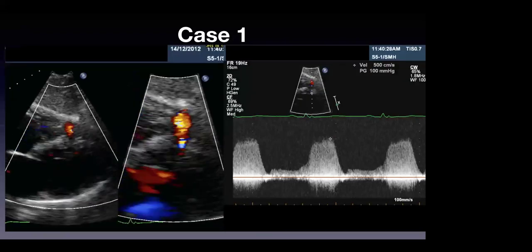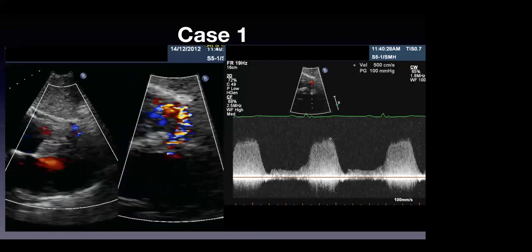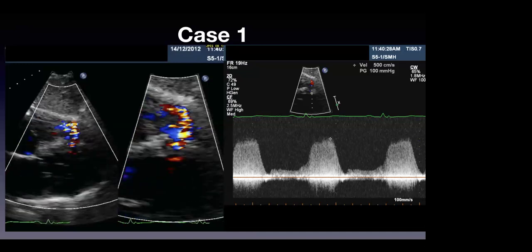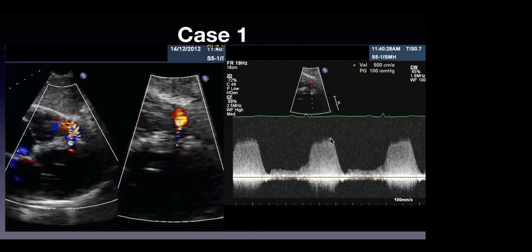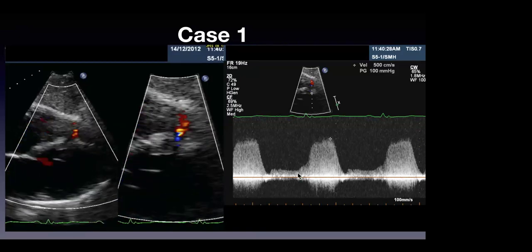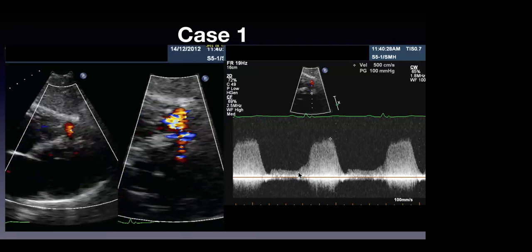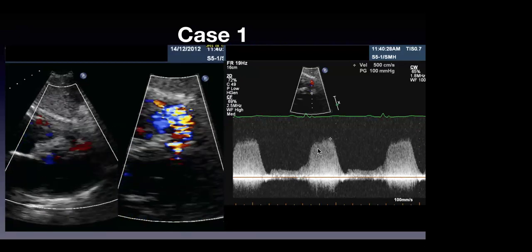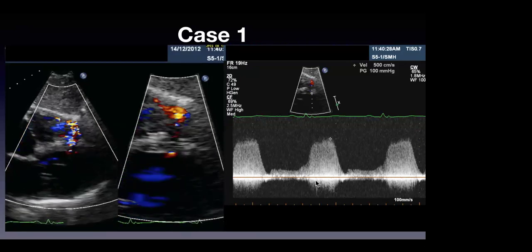And here's a subcostal view, really nice images, right? You can see we've interrogated in multiple views. There's predominantly systolic flow, with a little bit of diastolic flow, and you can see that on the CW spectral Doppler on the right. It's predominantly systolic, with high velocities as expected if it's a muscular VSD. A lot of times they're not necessarily pansystolic, depending on the dynamic nature of it. You might hear more of a systolic ejection type of murmur as it closes down, but this one looks like it's predominantly going to be pansystolic, perhaps based on the size of the defect.